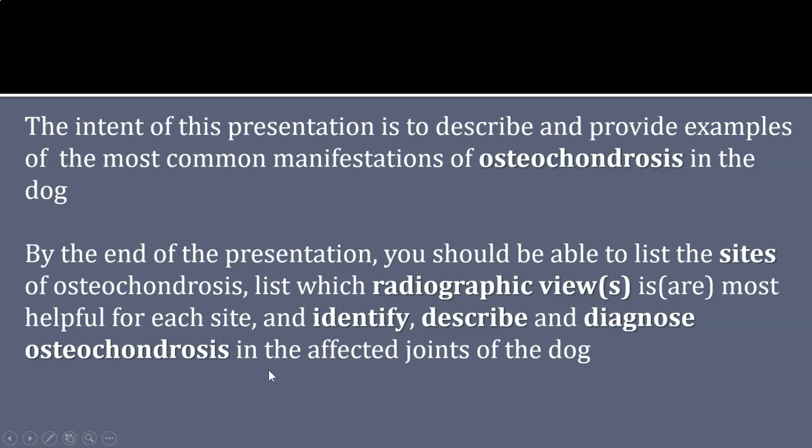Pay close attention to the exact location of the lesion in each joint. This is something you should commit to memory so that you know where to look when evaluating a patient with joint disease.